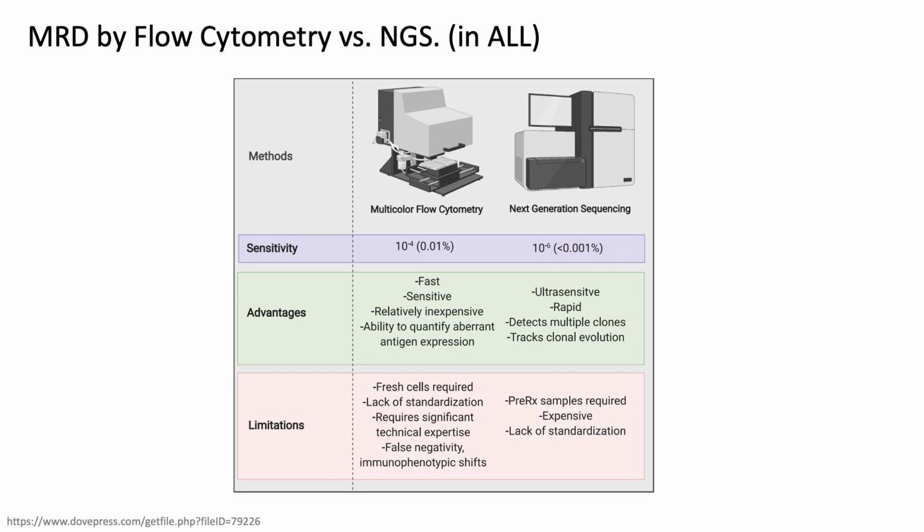Compared to the NGS approach, it's up to minus 6. It's relatively rapid, within 2 weeks, 7 to 10 days. The problem is that it's still expensive, but as I mentioned, this will change very soon. And there is the issue of lack of standardization. So this is still an issue, but it's going to change fast.